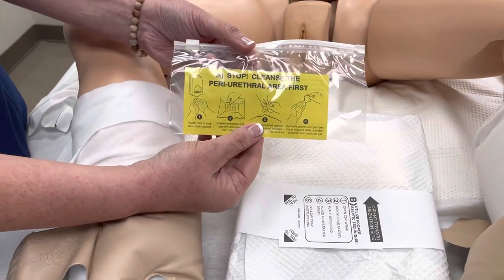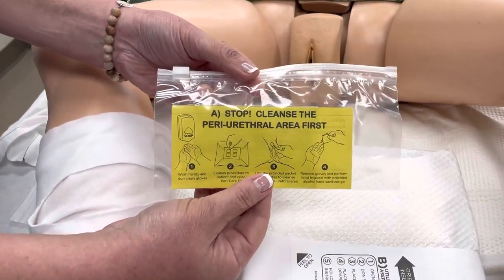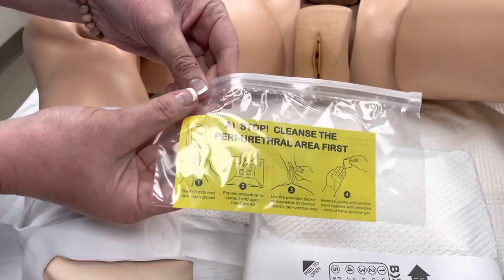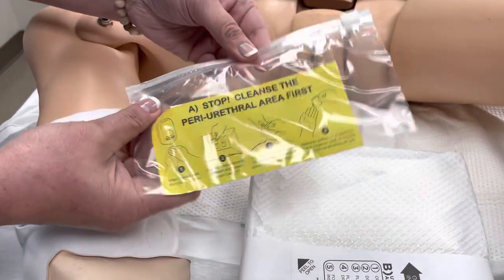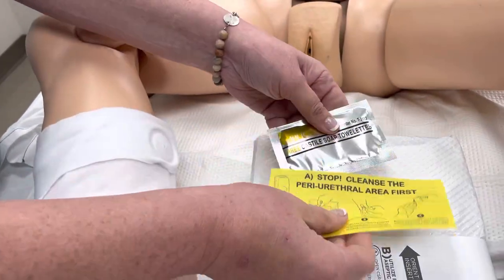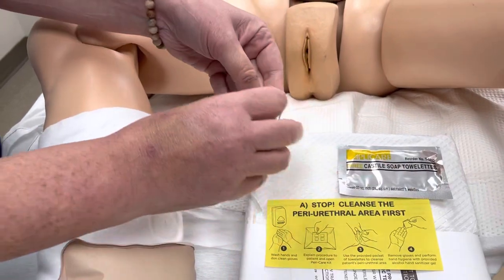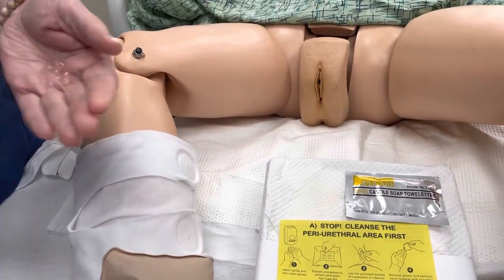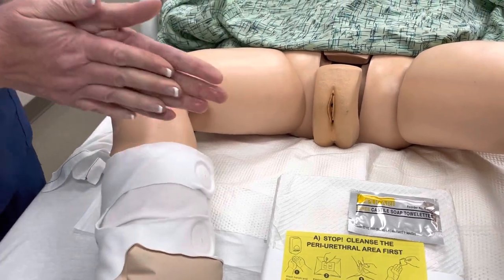Lastly, you're going to find a ziplock bag with a large piece of paper that says 'stop, cleanse the periurethral area first,' along with a couple different pieces of equipment. The first thing you'll find is some hand sanitizer, and you're also going to find some Castile towels. You'll want to go ahead and put on some gloves.